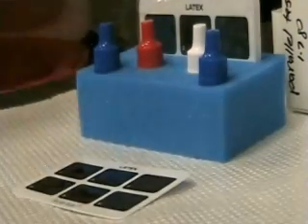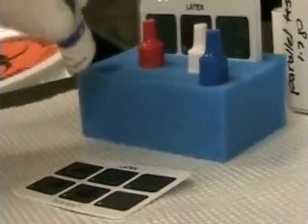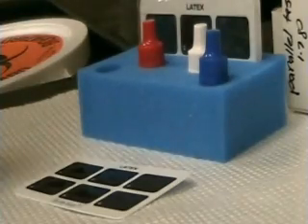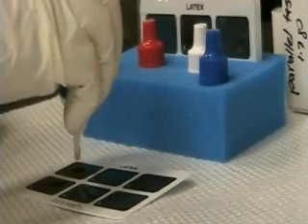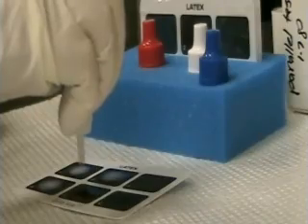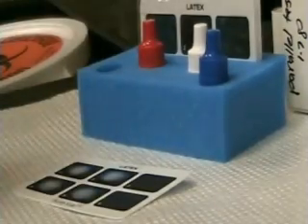Next, gently re-suspend your latex coated particles. Place one drop in each reaction square. The reagent is a suspension of polystyrene latex particles of uniform size coated with human IgG. The latex particles allow for a visual observation of the antigen-antibody reaction.